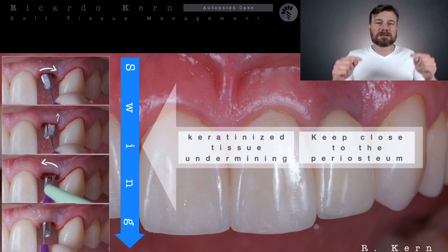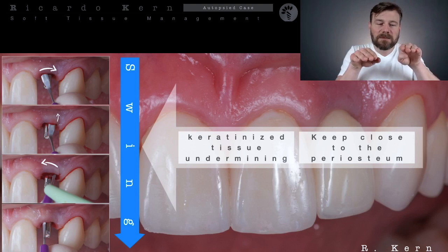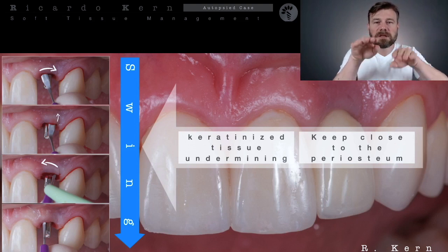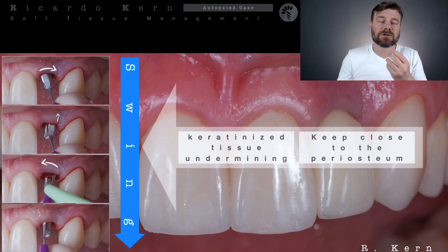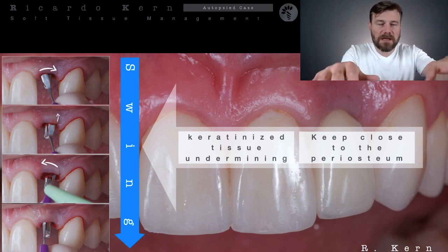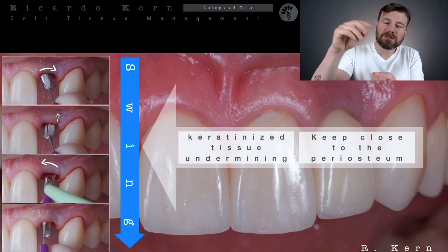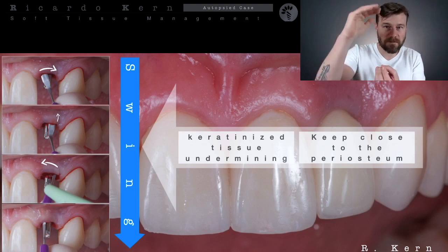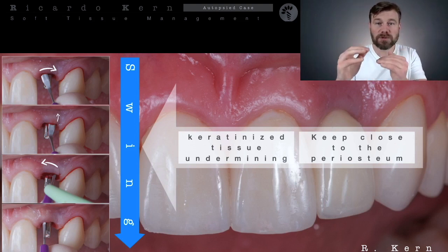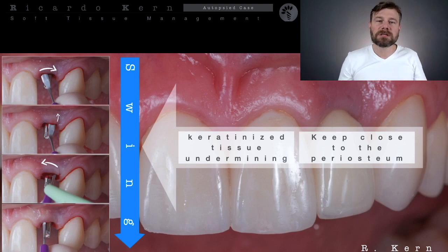What happens when you advance, retreat, advance a lot, is that sometimes you split the tissue at different levels, okay? And it's going to be more difficult for you to connect the areas that you advanced and retreated. And sometimes you leave some parts of the soft tissue still attached from the flap, from the surface to the ground. So you don't have an open and clear space to bring your connective tissue inside this tunneling area.